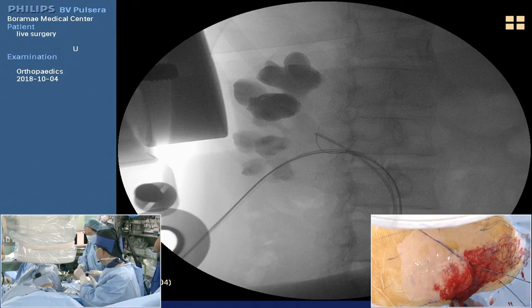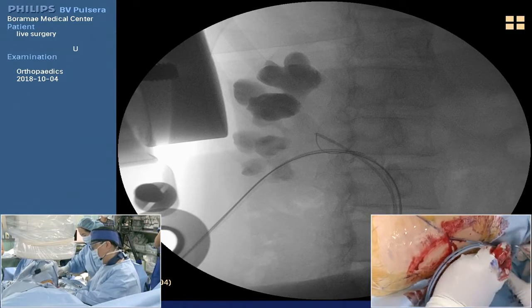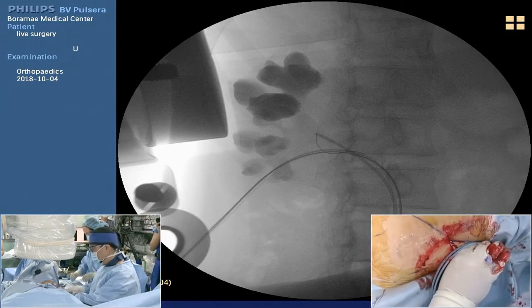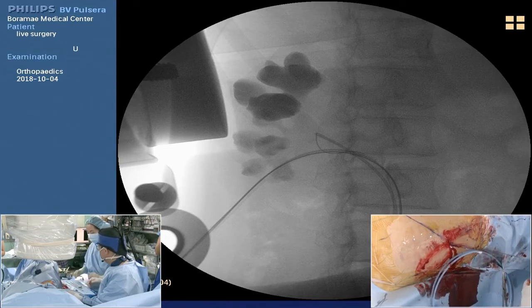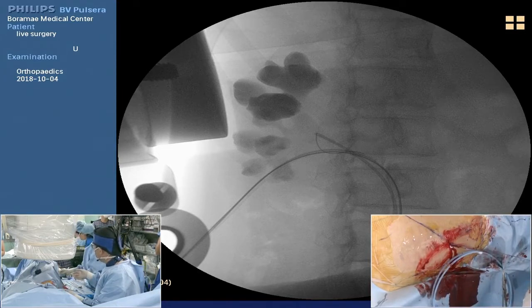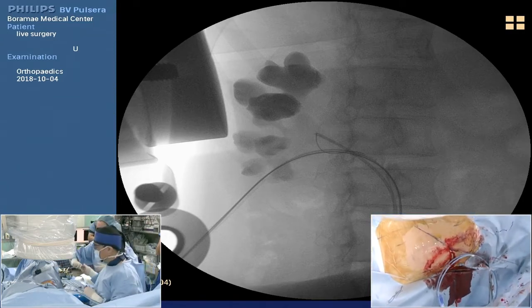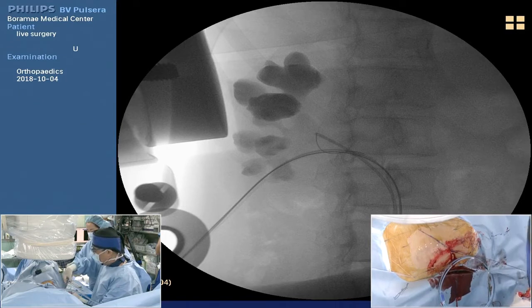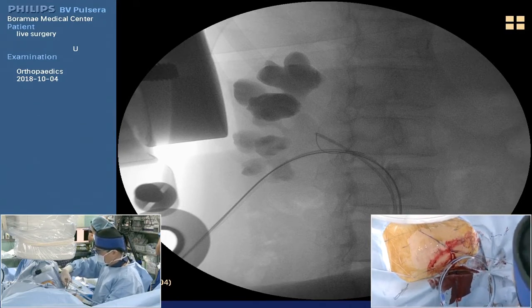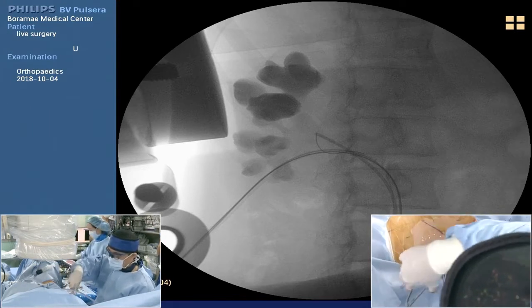So I'll do the tubings. So I ask the panel, does every one of you use a safety guide wire? I know from your talk this year that you don't use it, Professor Zeng, but about the others. So Joyce, do you keep a safety guide wire next to the access sheath? I try to place one, but it's not always possible. So we try balloon dilatation. 18 French balloon, please. You, Ahmed?